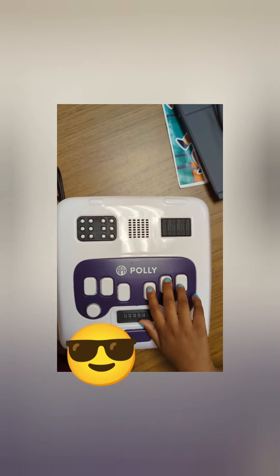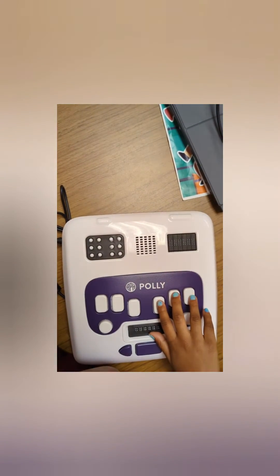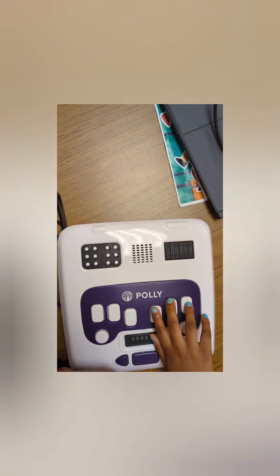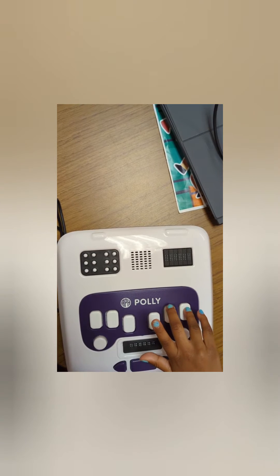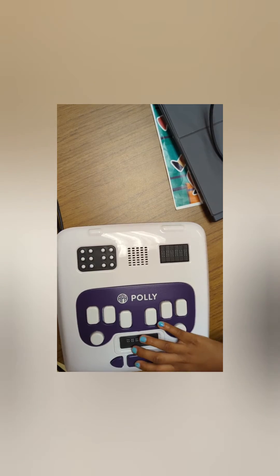Type key five. Wonderful, you got that right. Type key six. Great job, that's the right answer.